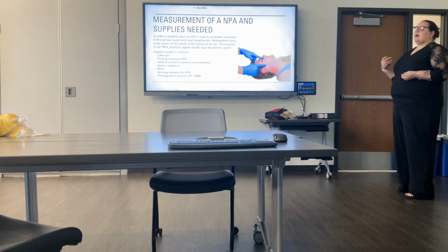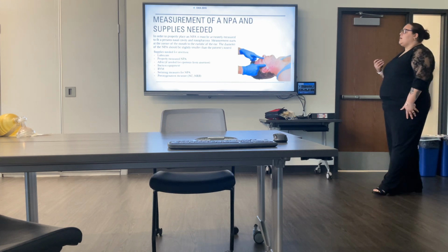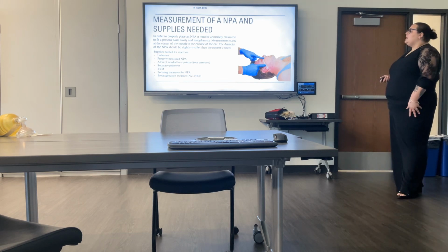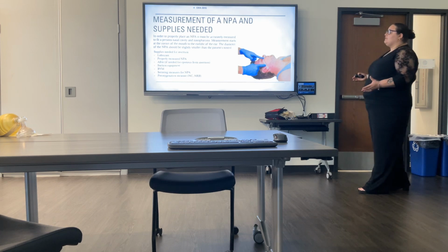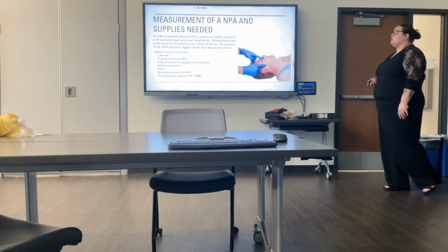BVM, you will need that to provide the positive pressure ventilation once we have placed the NPA, to give them more highly concentrated air through the BVM. Security measures for your NPA, you follow your local protocols for whatever it says your NPA securing is, whether that be tape, whether that be leaving it, or if you have a common commercial device to secure it.